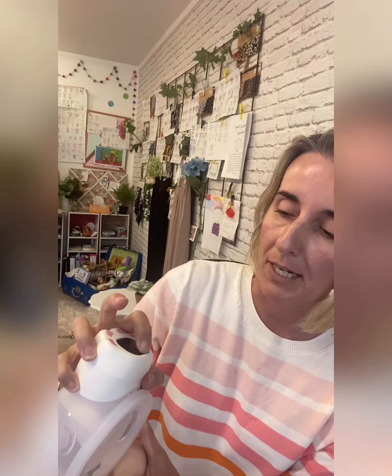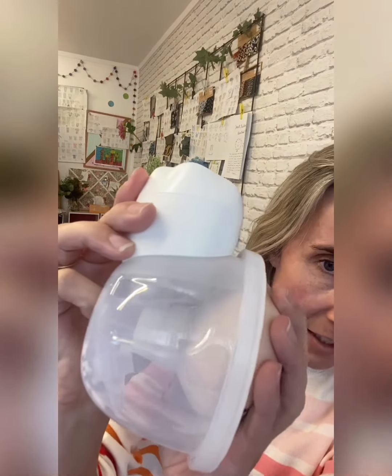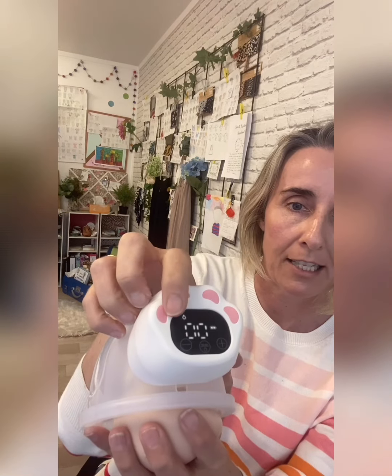It does have a USB charger and an internal battery. You turn it on and you want to do a fast mode first for stimulation — the nipple is being pulled in and out of the tunnel. Once you start getting let down, you go into the lactation mode, which goes into a longer, slower, rhythmic suck, and then you can increase or decrease the level to what's comfortable for you.